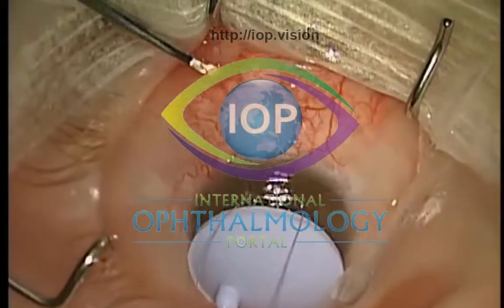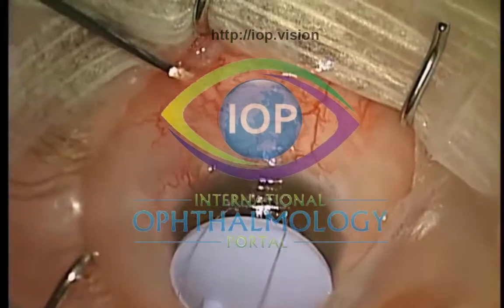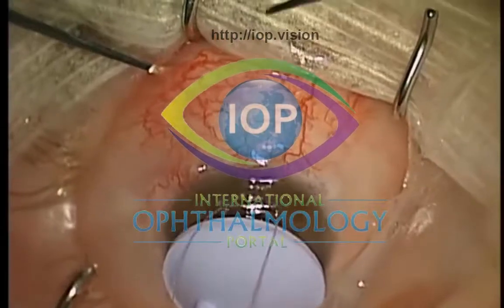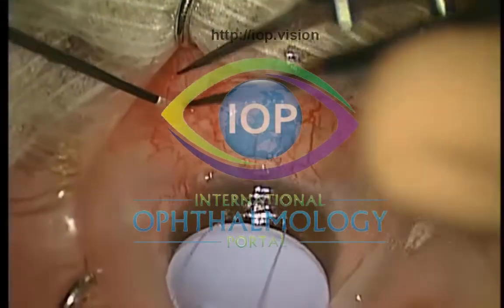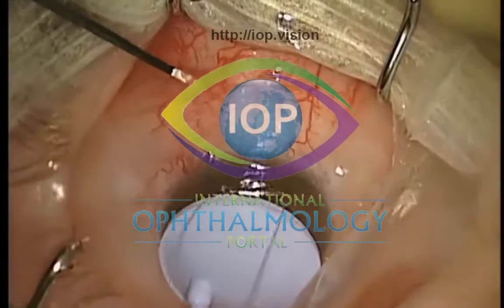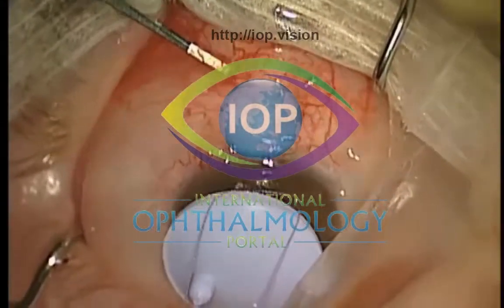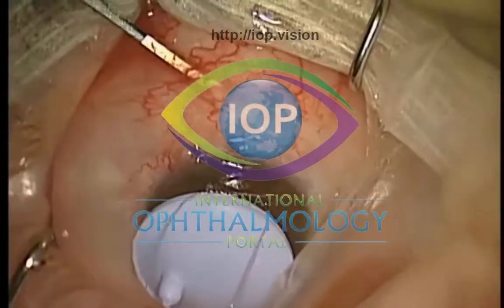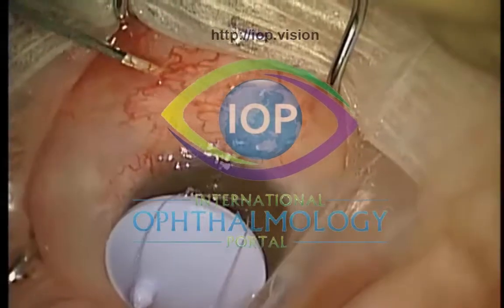If the patient is uncomfortable topically, I will put in beforehand some subconjunctival Naropin, which is quite nice to give them a bit more anesthesia. If the patient is uncomfortable with the topical, subconjunctival anesthetic can also be useful. Occasionally I'll put a swab soaked in local anesthesia on the ocular surface, or even just an absolute tiny amount of sedation if the patient's under operative conditions in the theater.